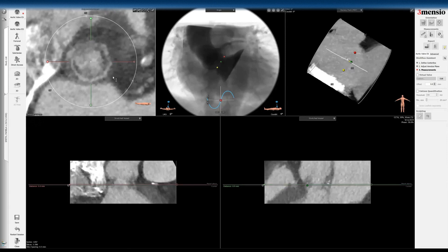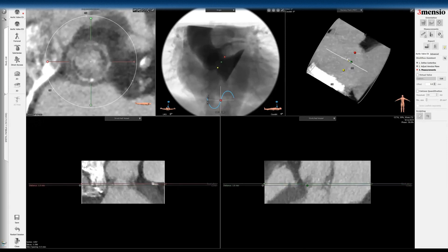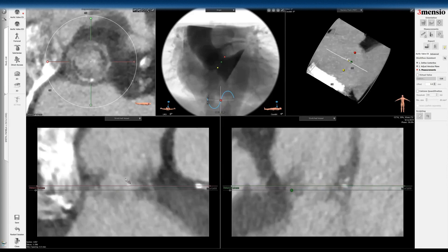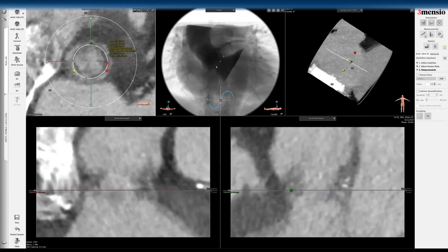So it's going to be a 20mm balloon-expandable valve or a 23mm self-expanding valve. Looking at the dimension, it should ideally be a little bit smaller than that, but you have to be mindful of the anatomy here — so it may actually end up being a little bit smaller.